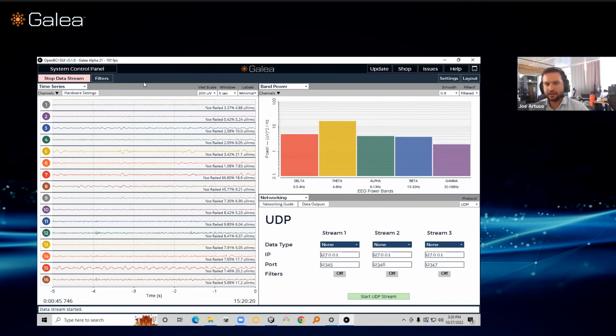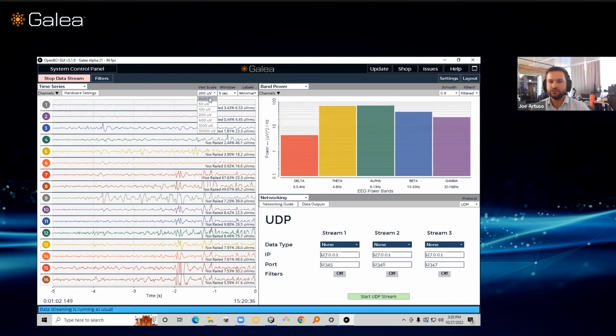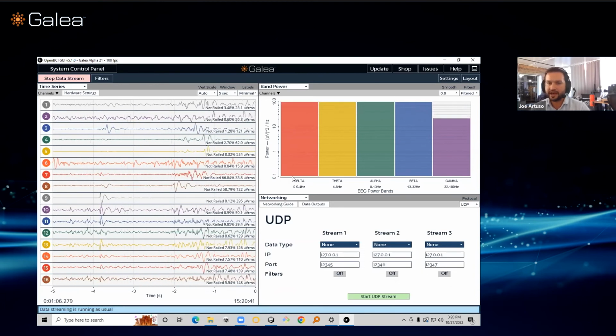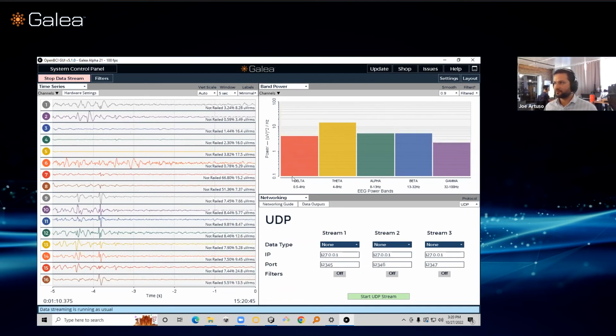I can say, we've actually already built some for SSVEP and P300. We've used those internally to test different versions of the hardware and software. Part of the plan is certainly to package those up into starting templates that come along with the software and the other Unity packages that we're releasing as part of the system. Yeah, absolutely.